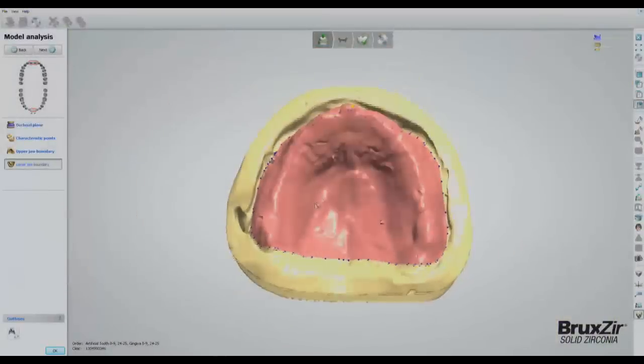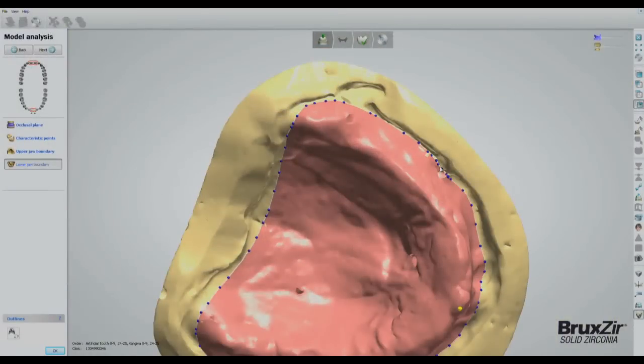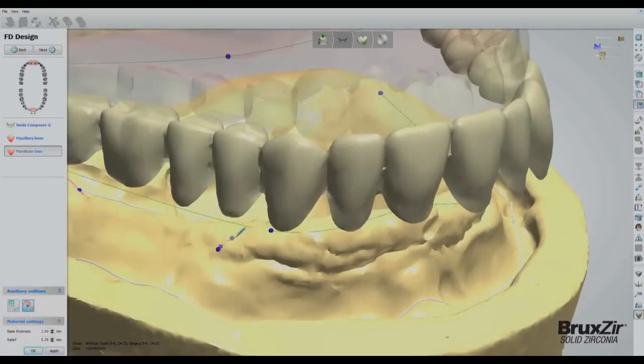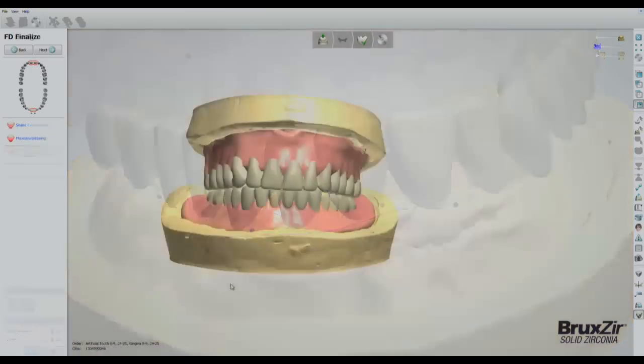First, we take the scanned model of the patient's edentulous arch and use CAD-CAM software to digitally fine-tune the design of the denture.